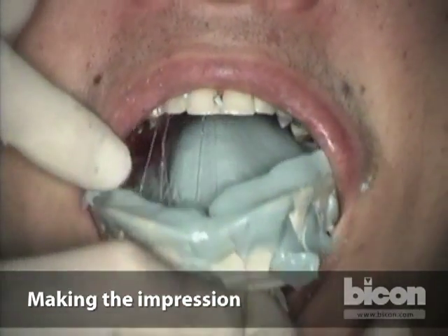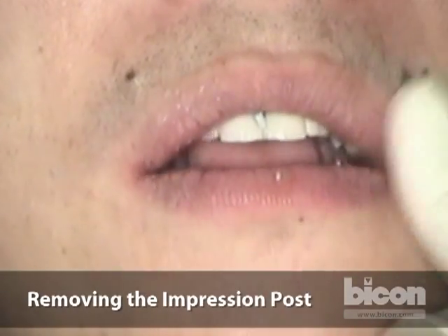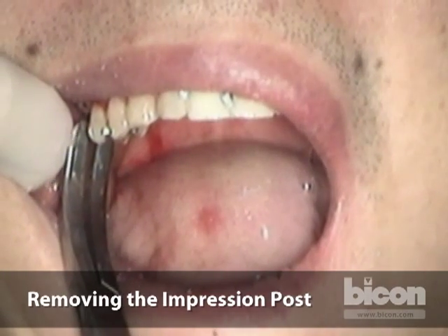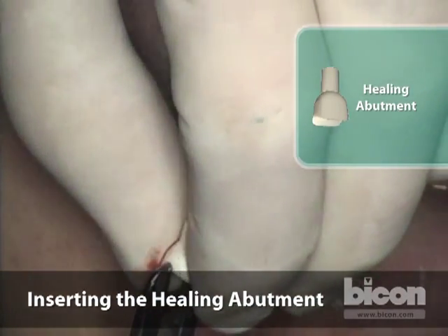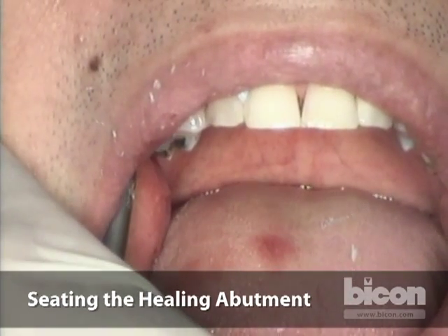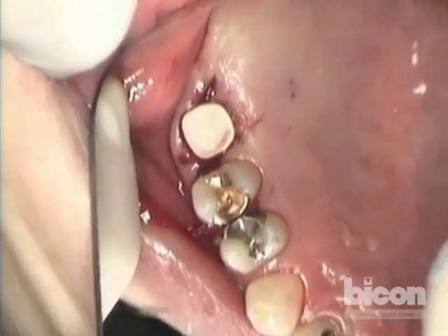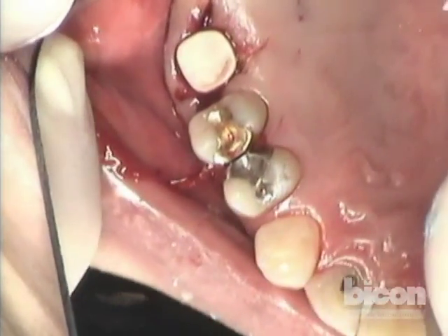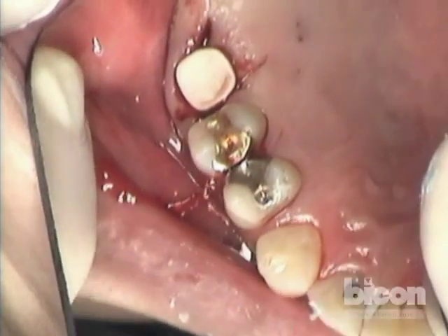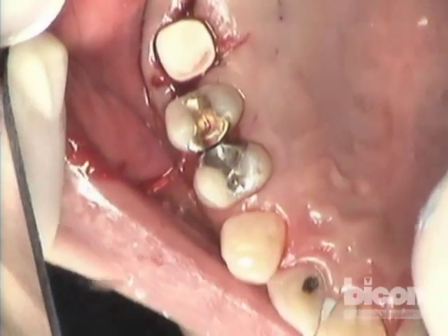The impression is just about set; we'll remove it. The acrylic sleeve should remain in the impression. To remove the green 3 mm impression post, simply remove it. Since it's a non-aesthetic area, we're not concerned about restoring it at this time — we'll simply put in a white healing abutment. It's nothing more than a round peg into a round hole, slight tap. Be cognizant that you allow sufficient room for the interproximal papilla — it's better to err on the side of a smaller diameter abutment than a larger. Do not encroach on the space of the papilla, and do not have it too far facially or buccally.